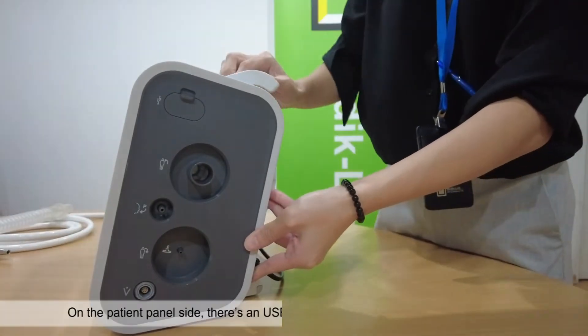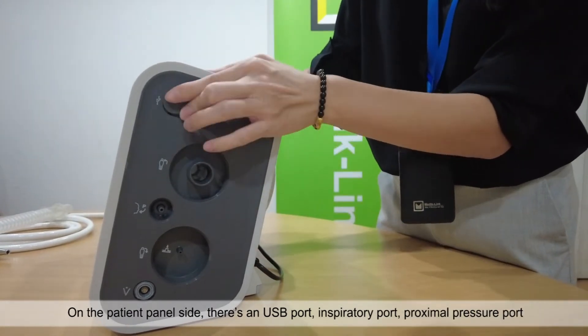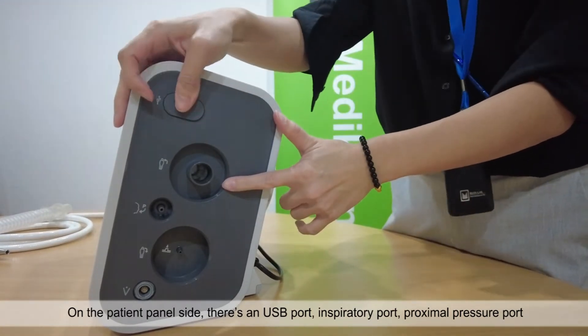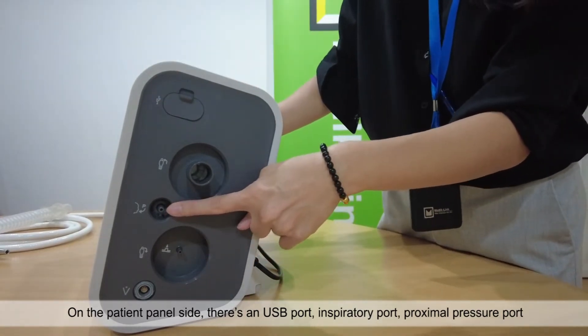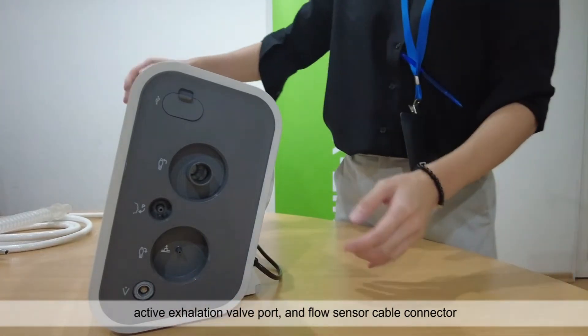On the patient panel side, there's a USB port, inspiratory port, proximal pressure port, active exhalation valve port and flow sensor cable connector.